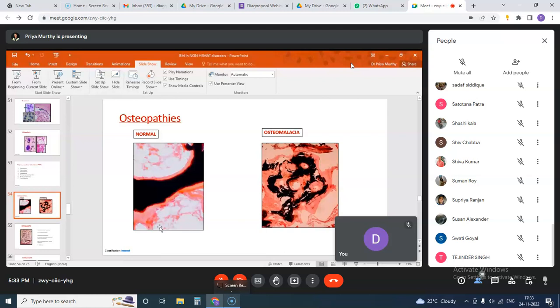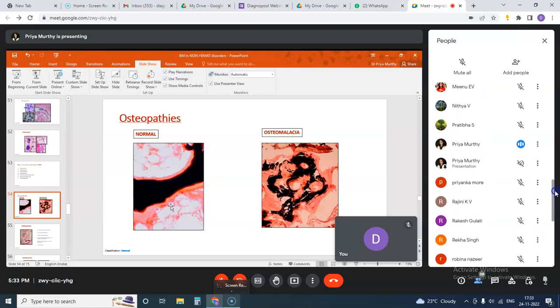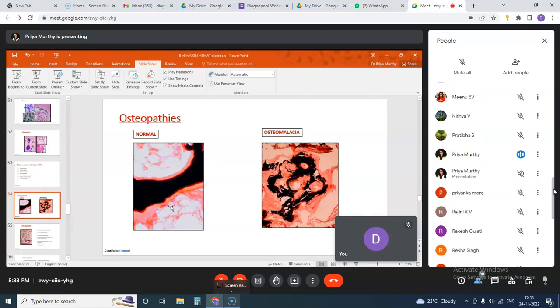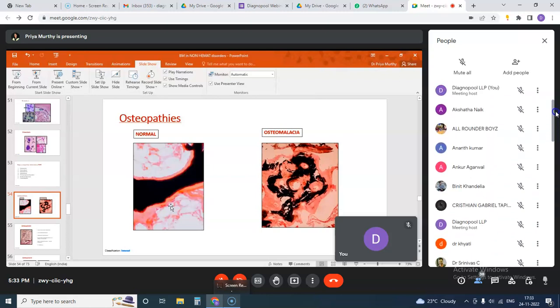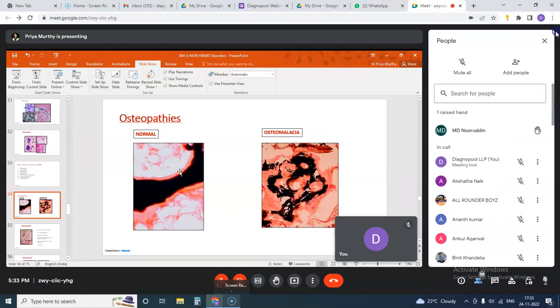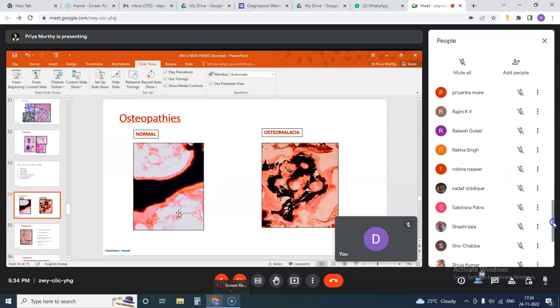Now, this is a structure of a normal bone marrow, and the stain performed here is the von Kossa stain. These are not usually performed these days, but earlier, to detect these, uncalcified sections were being studied, and these bone marrows were embedded in resin material like methyl methacrylate, and sections were subsequently stained.